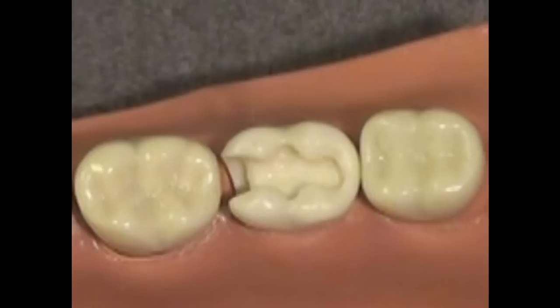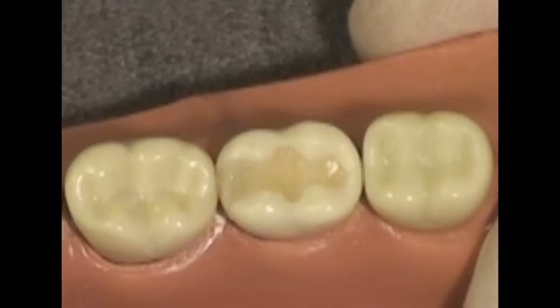This video will show dentists how they can save five to ten minutes of chair time by proceeding from prepared tooth to finished restoration with little to no shaping, finishing, adjusting, or polishing. Hard to believe? Just watch.